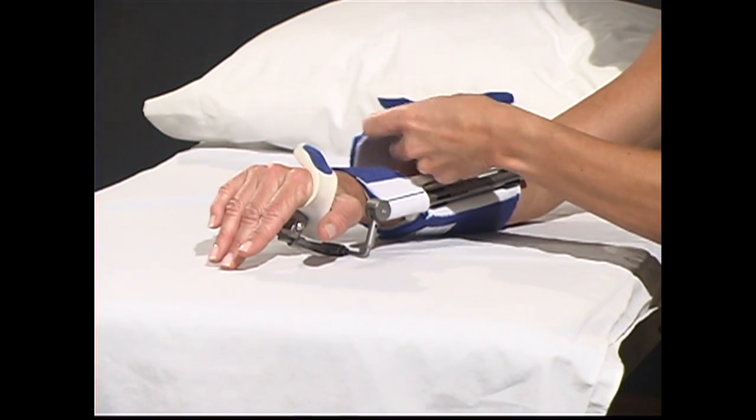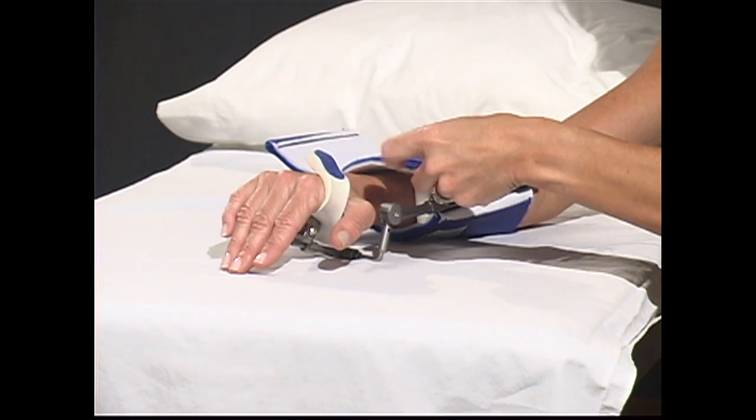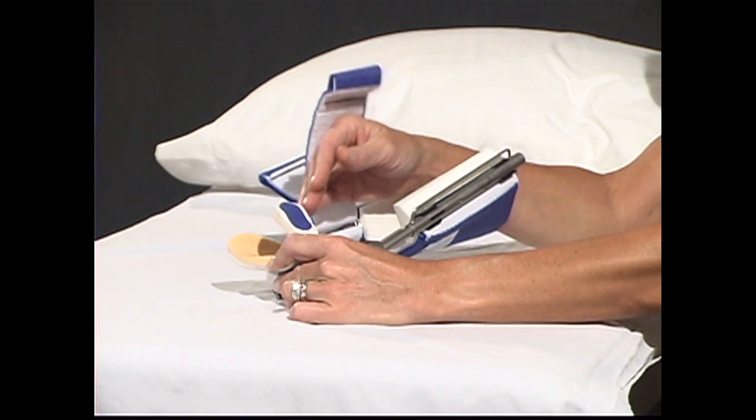In order to remove the DynaSplint, take off the cuff that says top of forearm and the two-inch strap that is at the top of the wrist. Slide the hand out of the unit.